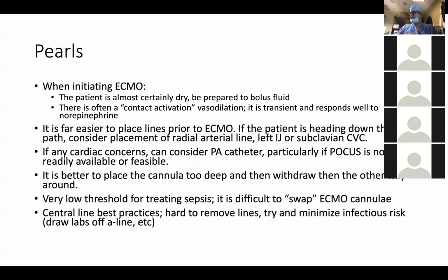Some pearls of wisdom for when you're starting to initiate ECMO. All these patients are dry, right? Everyone with ARDS, what are you going to do? Dry them out. A liter and a half negative a day, right? ECMO studies for looking at ARDS, good outcomes in ARDS, dry that patient out. Dry lungs for happy lungs. So you often always need to give some fluid back initially.